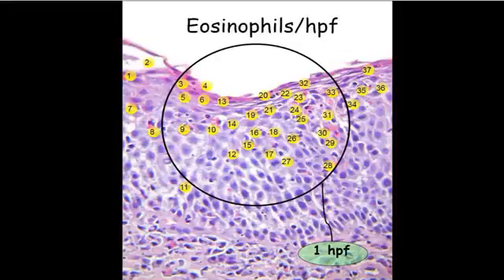They preview the slide. They know the drill for these esophageal biopsies is they put a dot where they think there are the most eosinophils, and they count, and then they issue a report with that number. And then I come along the next morning, and I eyeball it, and I think, wow, what were you smoking? Or no, that looks about right. And I tell them, look, a number that ends in 3 or 7, I'm likely to believe. If it ends in a 0 or a 5, I'm going to look at it and count because I can't believe it came out evenly.